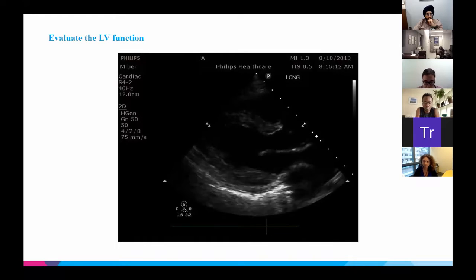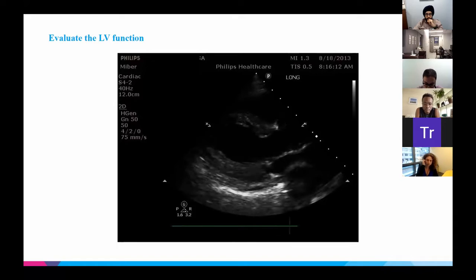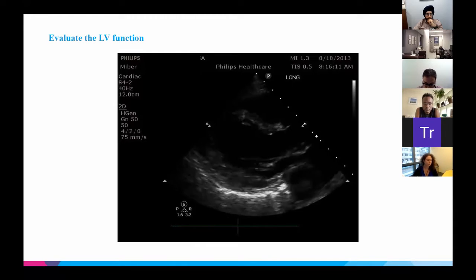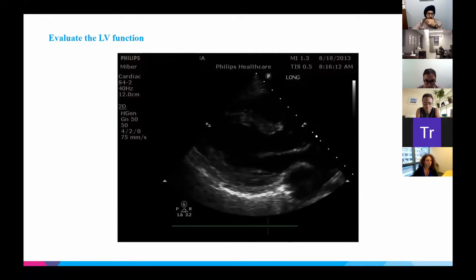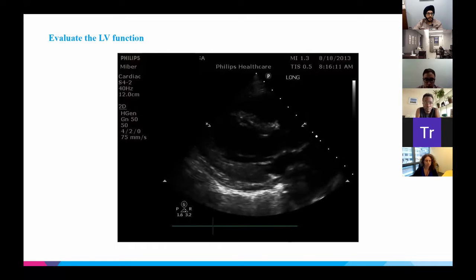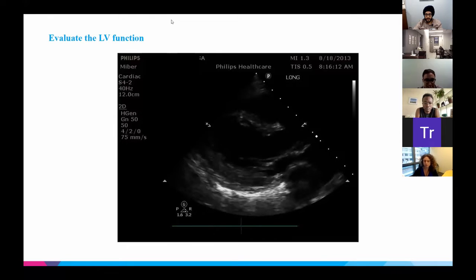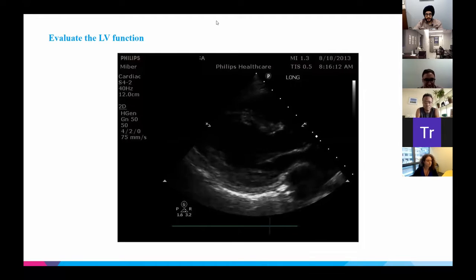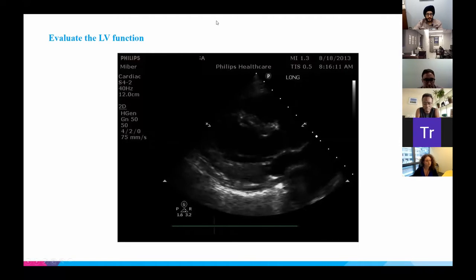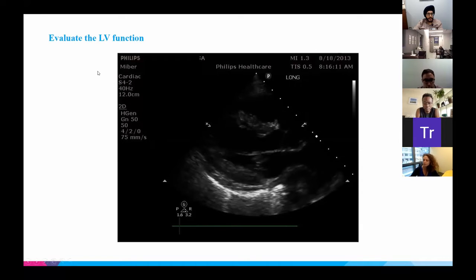We have 21 responses. Okay. 31. Good. So we're at 36 now. And then I guess, can anyone tell me what view this is? Fatma says parasternal long. Yeah. Okay. And then we want to end the poll. All right, 39 responses. And these are the results.